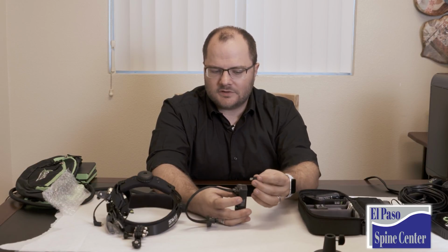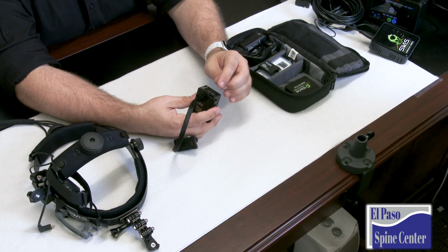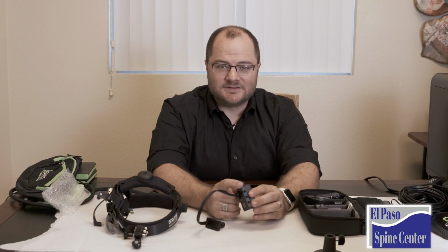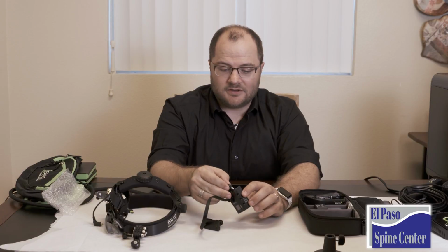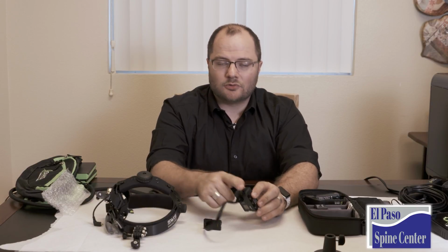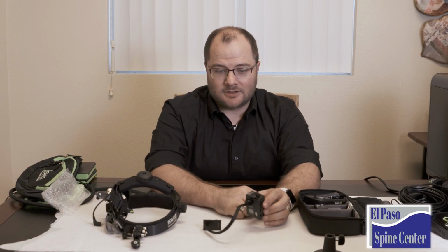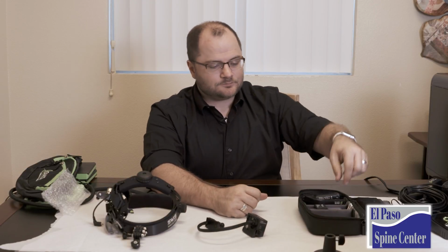Interesting thing here, there is a little USB dongle plugged into the GoPro. That is actually nothing. It's just a reminder that that port on the GoPro is not used. So leave that in. Make sure you're not plugging anything into it. You don't need it. The only thing you're going to need is the HDMI out, which we're going to get to in just a minute.